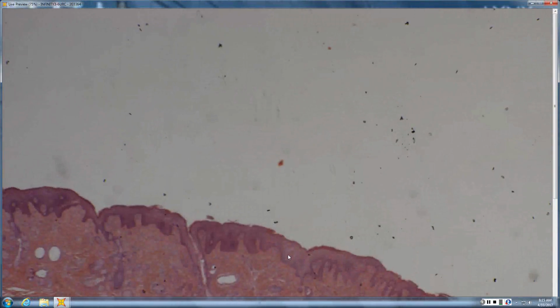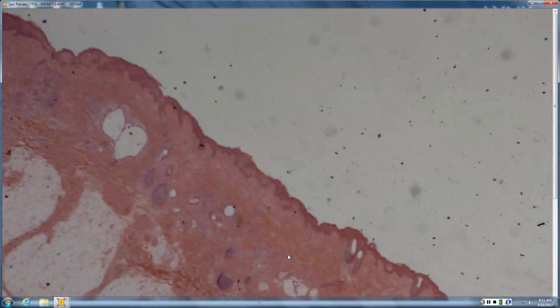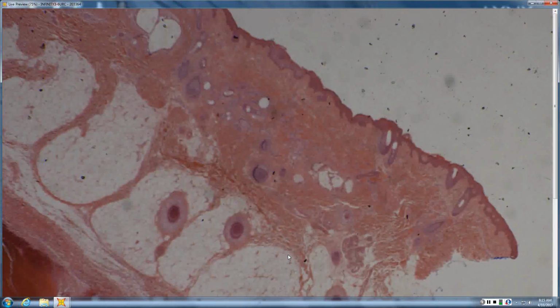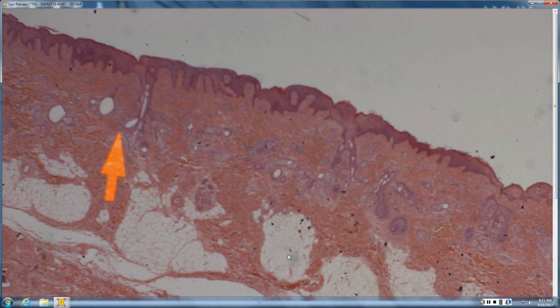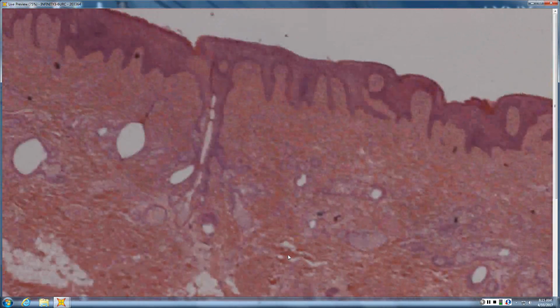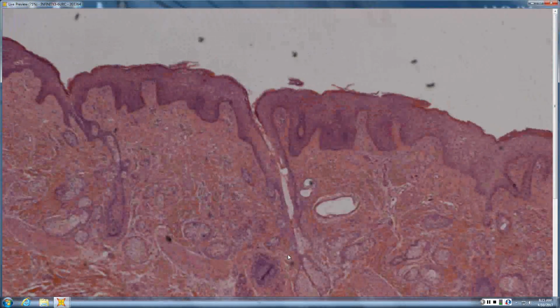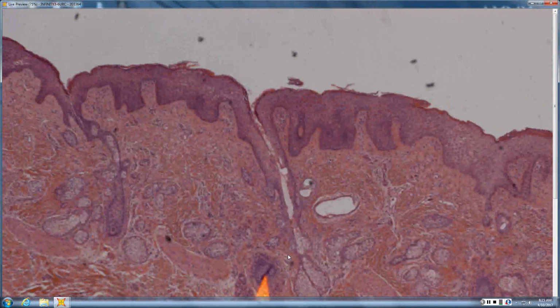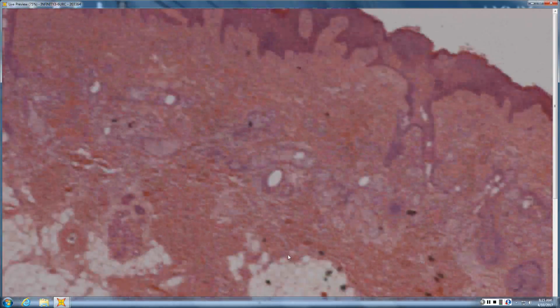So this is likely an excision of some sort. Where? Scalp. Where's the hair? It's missing there. And are all the hair follicles totally missing, or just terminal hair follicles missing? Terminal hair follicles. And instead, what do they look like? Lots of little bitty follicles all lined up.